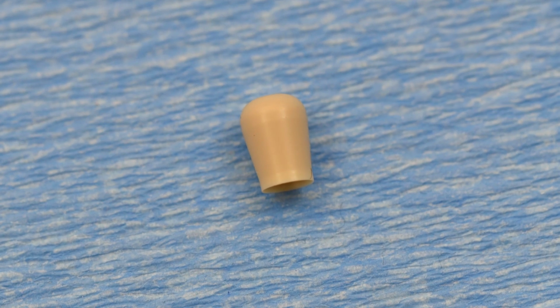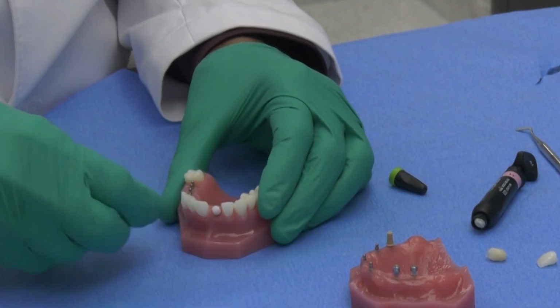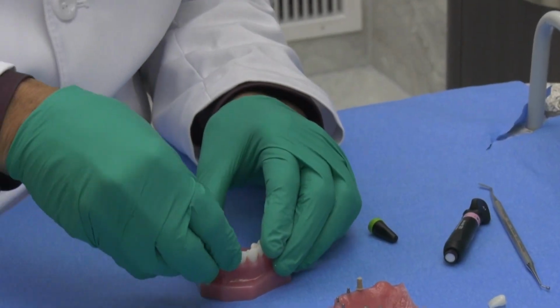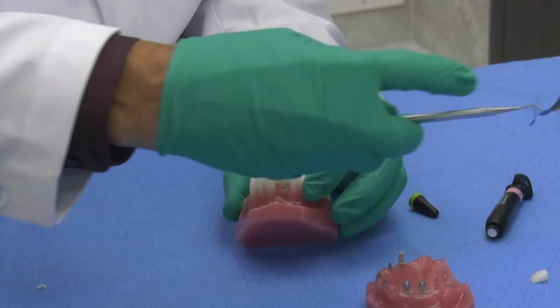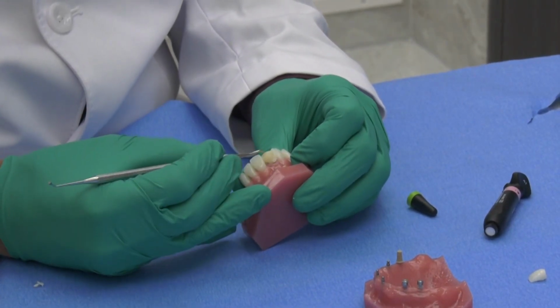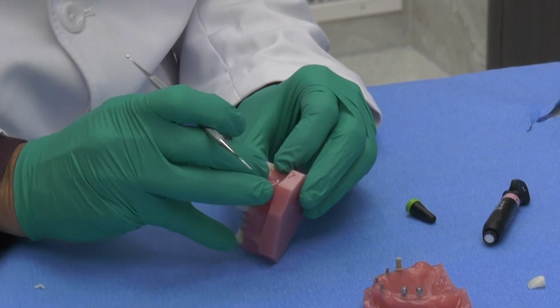To temporize on a mini dental implant with the ball and square, what we're able to do is take one of the white healing caps and press fit that right down onto the ball and square. And after you do that, you're able to take some composite and just pancake it over the top of that healing cap and shape it into the shape of a tooth, light cure it. And then I'll take my fine finishing burrs and shape this tooth to go over that healing cap. Adjust your bite, and that's your temporary.